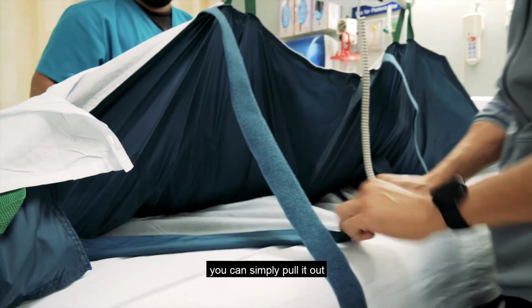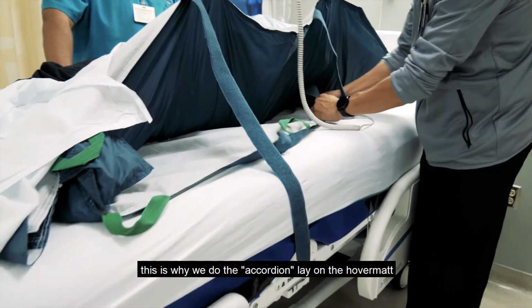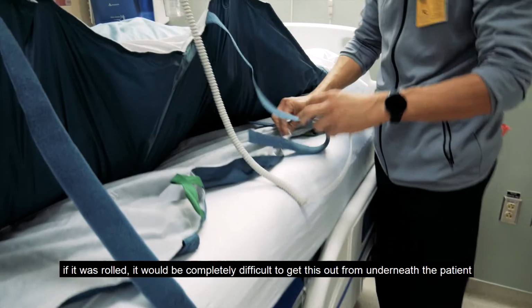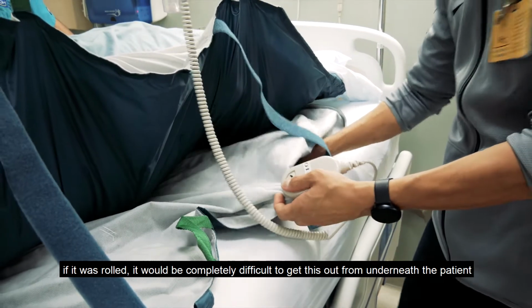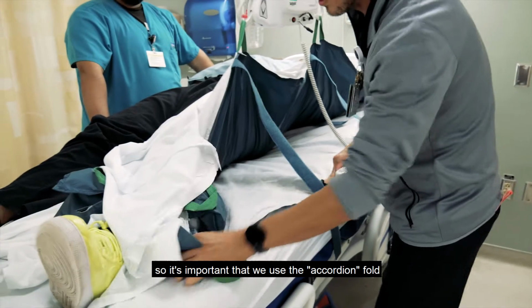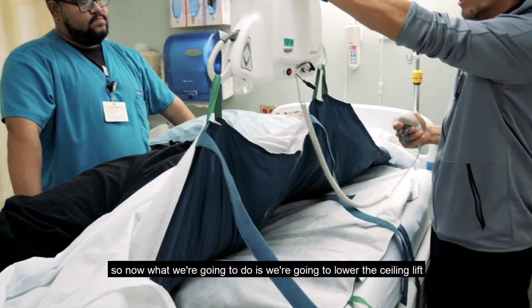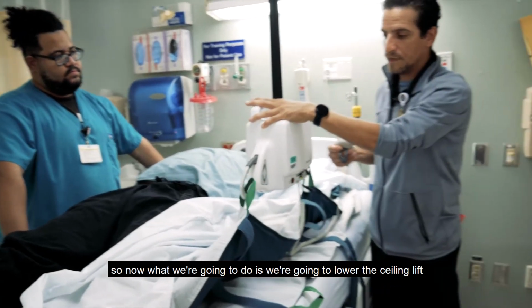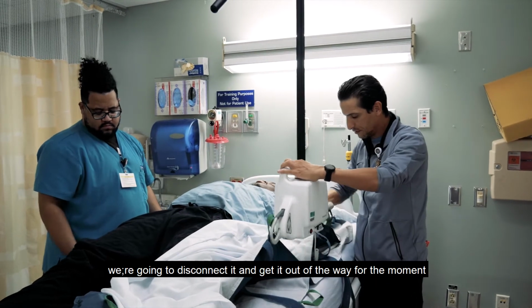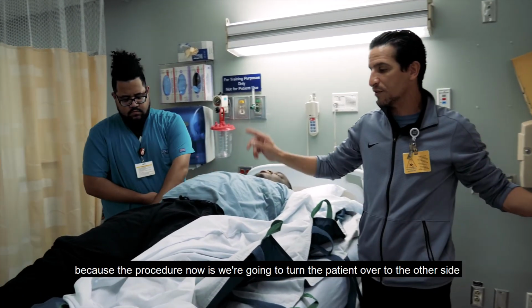you can simply pull it out. This is why we do the accordion lay on the hover mat, so that we can easily pull it out. If it was rolled, it would be completely difficult to get this out from underneath the patient. So it's important that we use the accordion fold. All right, so now what we're going to do is we're going to lower the ceiling lift. We are going to disconnect it and get it out of the way for the moment, because the procedure now is we're going to turn the patient over to the other side.